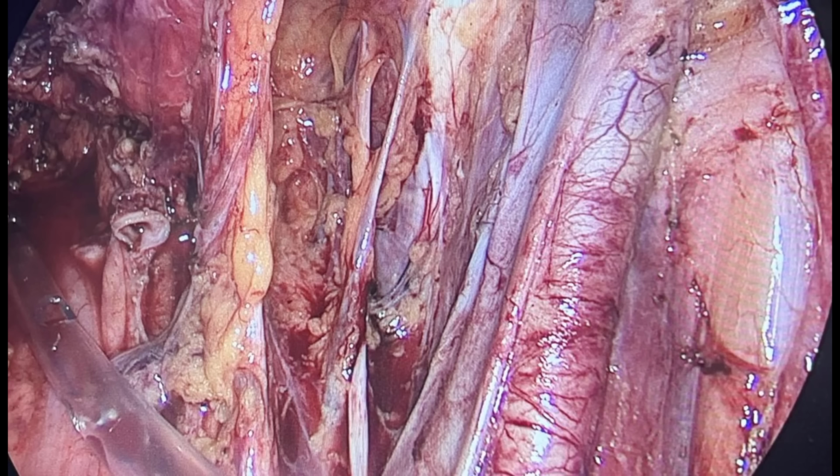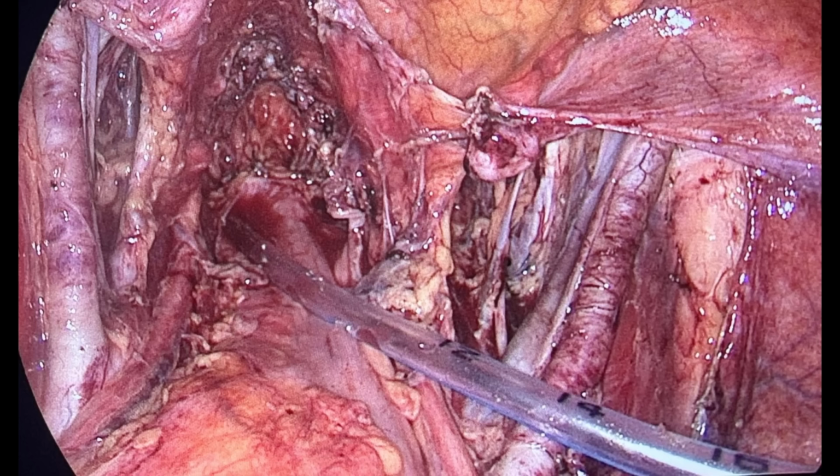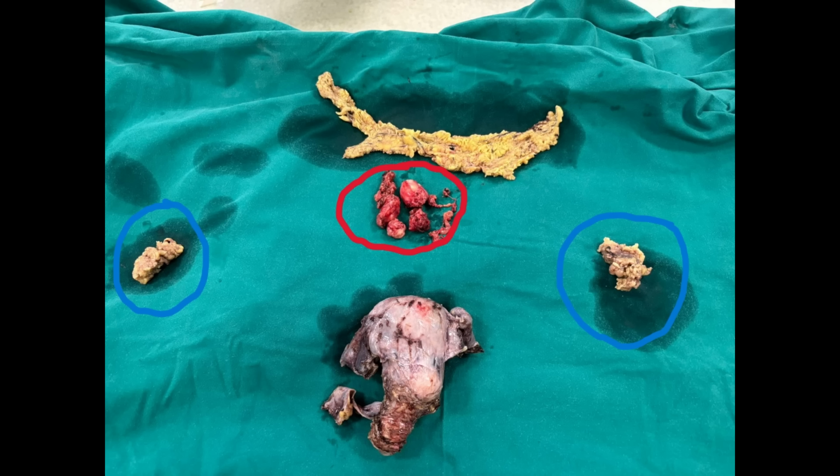This is the pelvic node area of the right side, the left side, and that's the final picture of the pelvis after we close the vault. That's then the picture of the specimen.